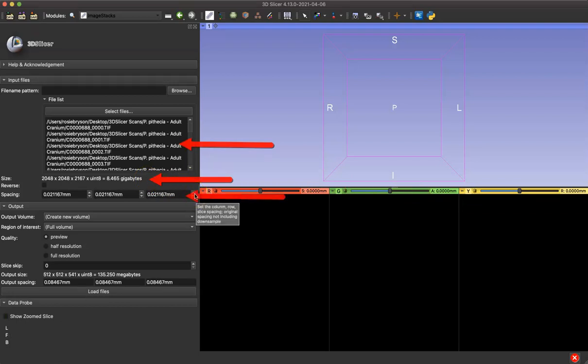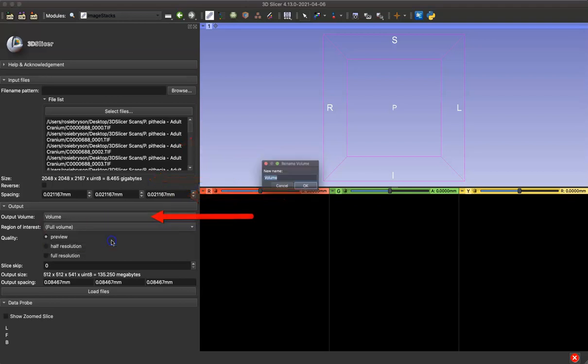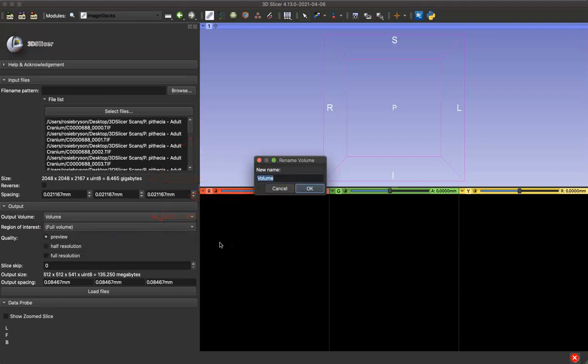You can adjust the spacing here before you load your data into Slicer. You can change the name of your volume that we're about to create by going to Create New Volume and typing in the name that you'd like.